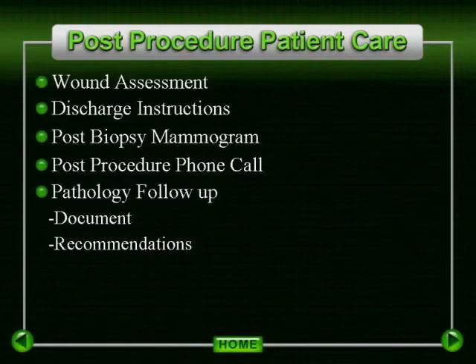Recommendations. The radiologist will review the pathology, dictating an addendum to biopsy report with any recommendations for follow-up. In most cases of benign pathology results, a follow-up MRI is recommended within 6 months to assure that there has been adequate sampling of the abnormality in question. This interval may be shortened if the lesion was highly suspicious for cancer.